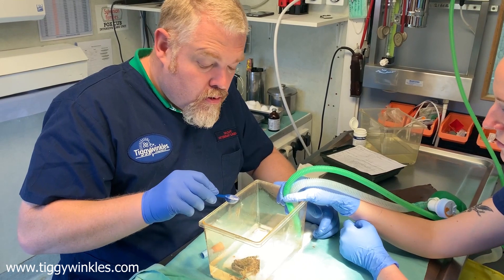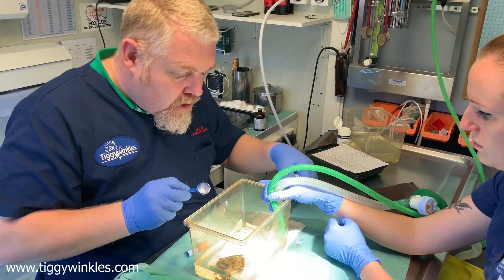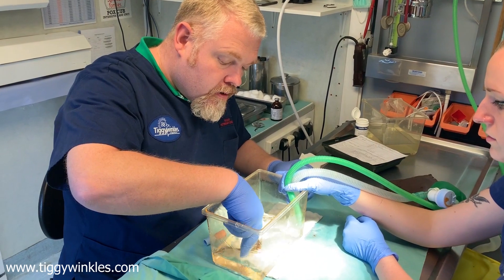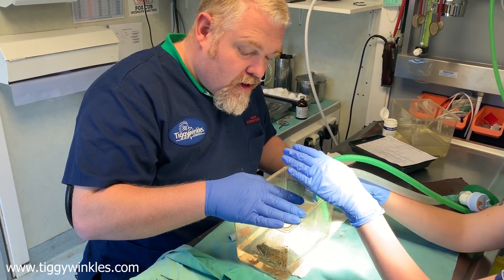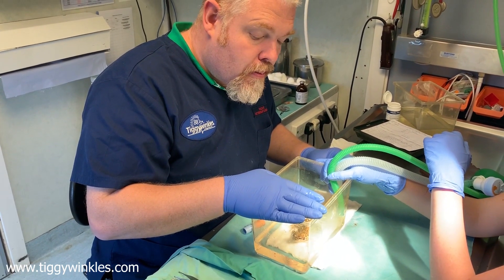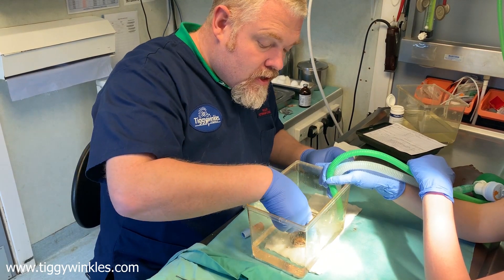We use MS-222, which is a fish and amphibian anaesthetic. We just sprinkle a small amount into the water, agitate it around a little bit, and then give it a few minutes to work. He's quite jumpy at the moment. We wait for that powder to take effect, and if it doesn't start to work shortly we can always add a little bit more. We try and add it bit by bit because once we add it we can't really take it away — so adding it gradually, seeing how they go.